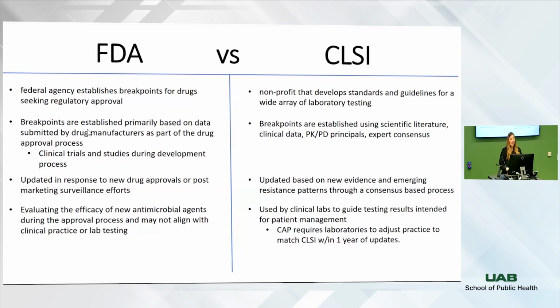So CAP is another regulatory agency that our lab here at UAB uses, and we have to be evaluated from them to get funding from CMS, basically. And so CAP now has required, hey, we don't want y'all actually using these FDA breakpoints anymore. We want you using CLSI breakpoints.